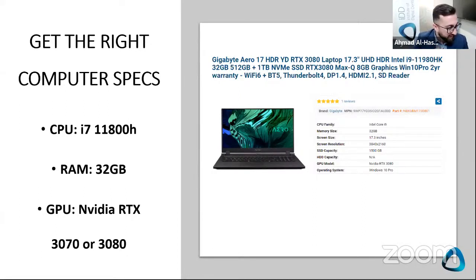Now, a few things. I'll get to some of these questions. I don't scan in HD at all, John. I hardly use HD, never needed to use it. HD, for those who don't know, is a setting on some scanners. I know iTero does it routinely for crowns, and Medit has the option. I've done quite a lot of testing about the files and what they look like between HD and standard definition. I've never needed to use HD. So definitely, with good protocols, you don't really need to use the high definition.